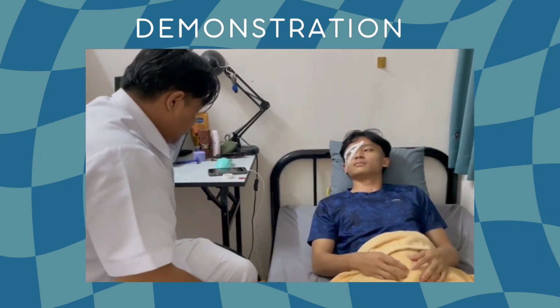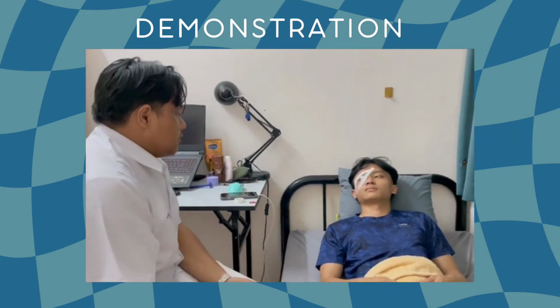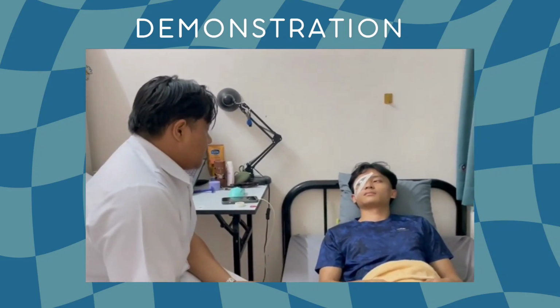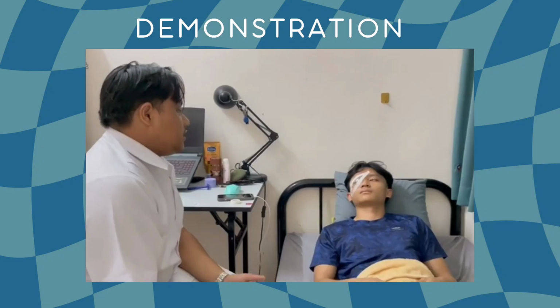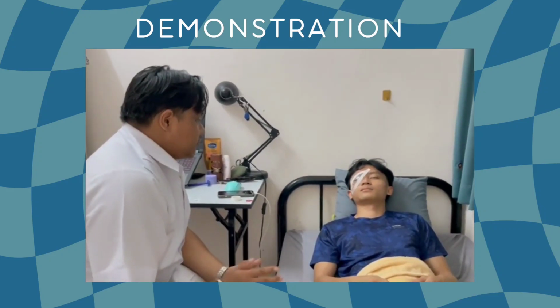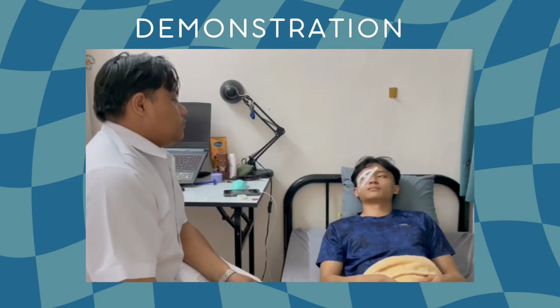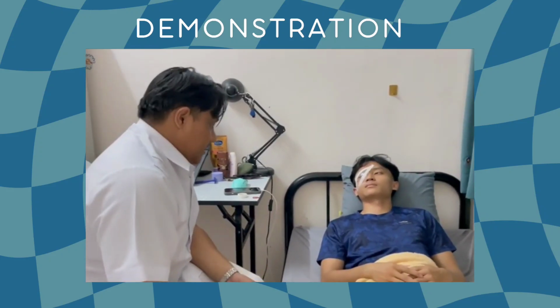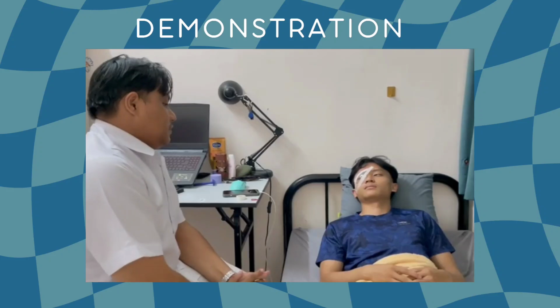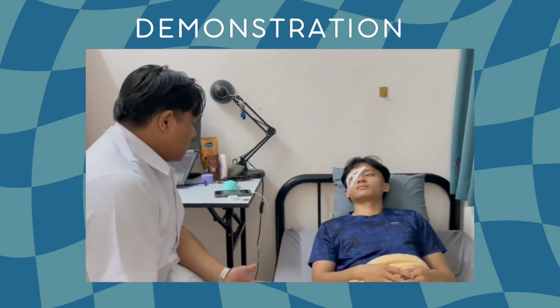There are a few things that you need to know when you are using the eye shield. You need to clean the eye shield once a day, and usually you only use it when you are going to sleep, or when you're going out in public, or when you are exposed to dust. Right. So do you have any questions about the usage of the eye shield?